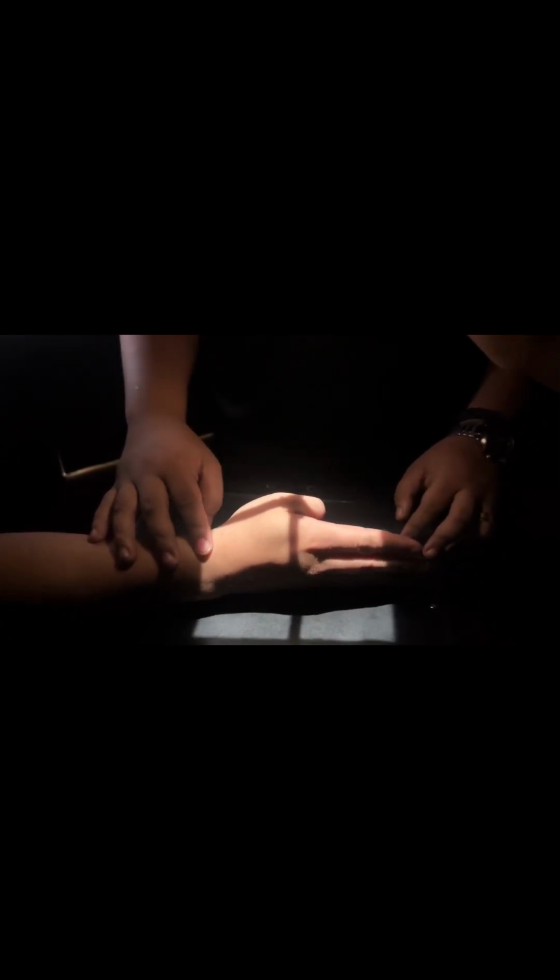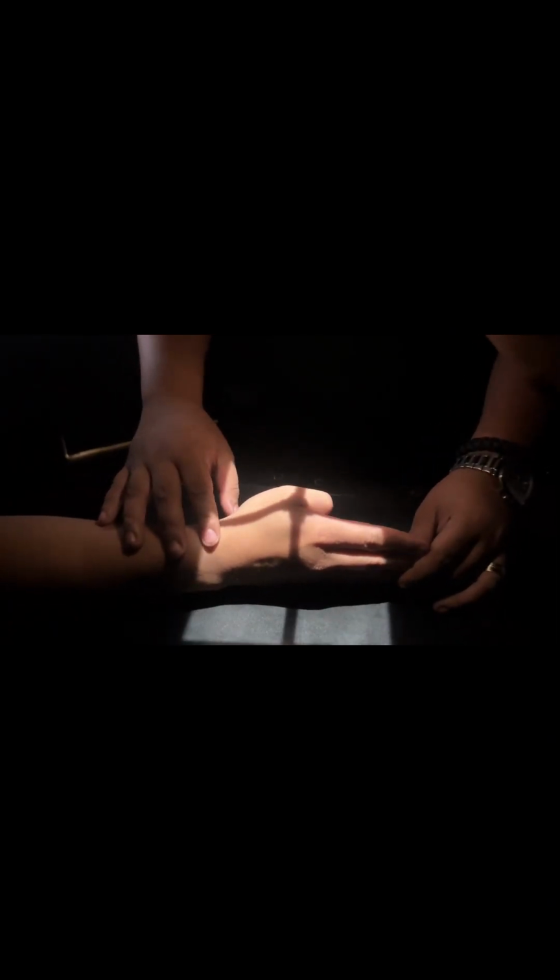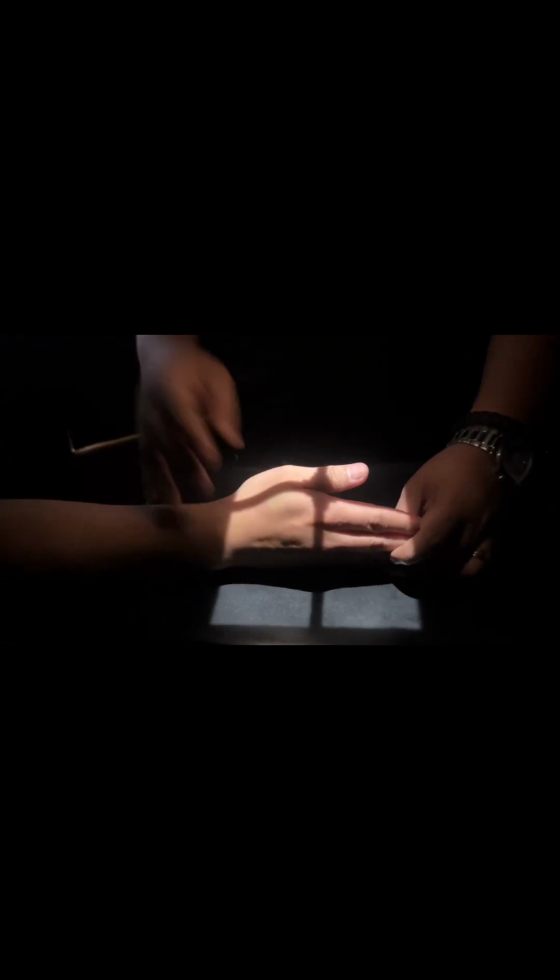So part position, place the hand in a true lateral position with the ulnar aspect down. Fingers extended and superimposed with thumb placed parallel and slightly anterior to the hand. Align long axis of hand and forearm with the long axis of the IR. Ensure the hand is not rotated. Verify by the superimposition of metacarpal heads. And the central ray is perpendicular to IR, directed to second MCP joint. Like that.